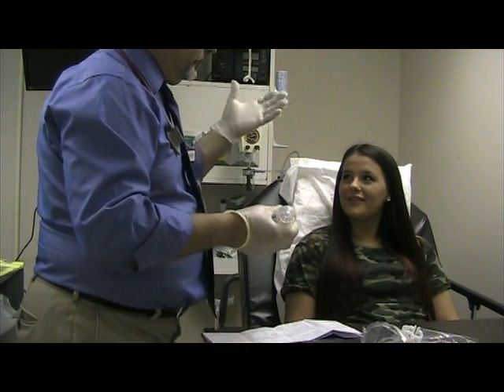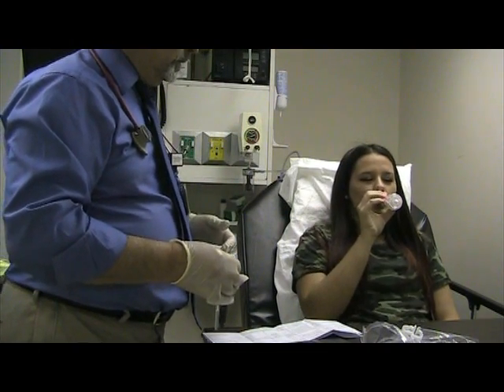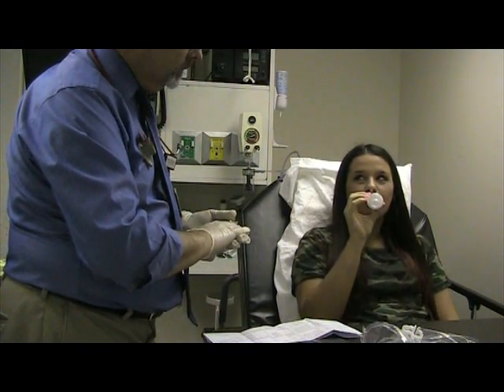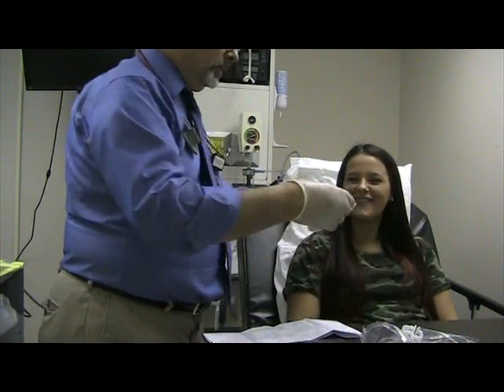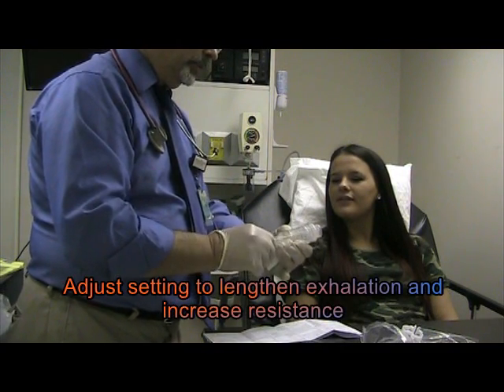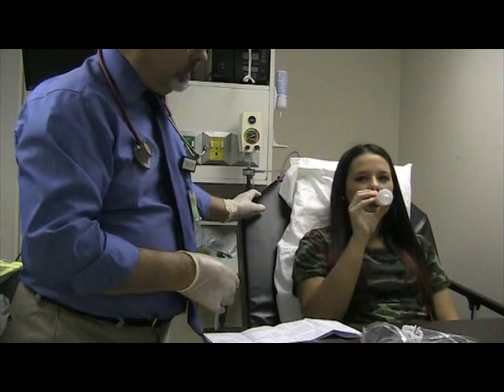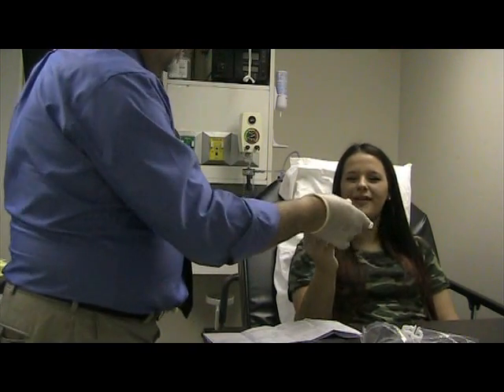You just inhale through your nose, exhale through your mouth. Keep doing that in and out. Is that pretty easy? Yeah, a little harder? A little bit but it's still pretty easy.